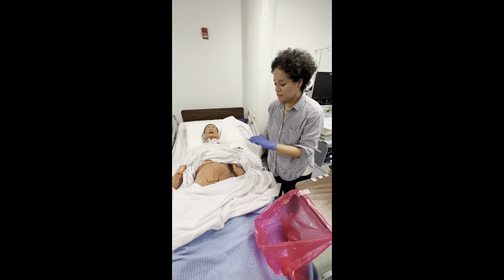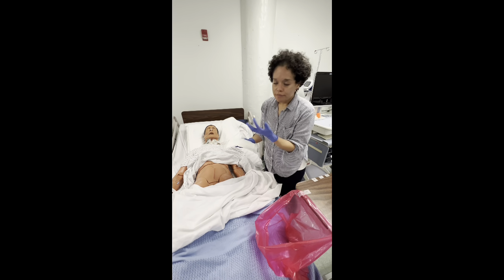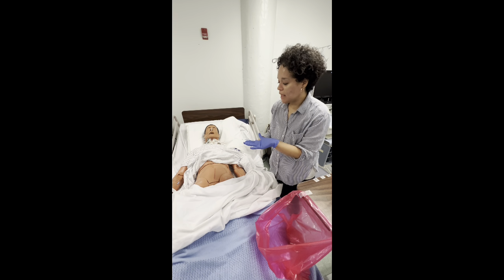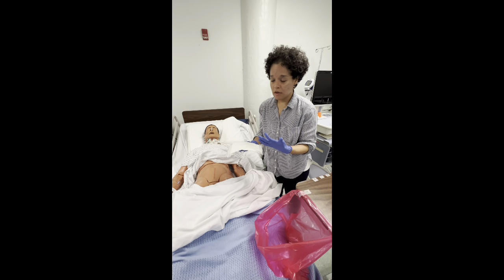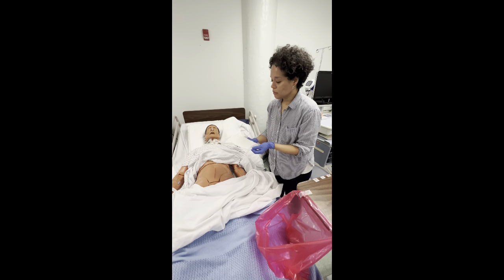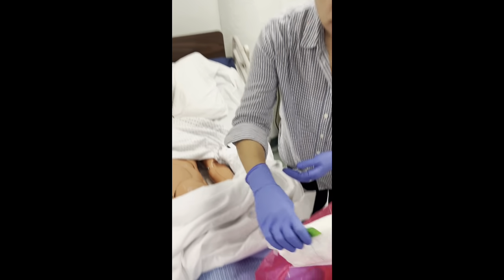And then consistency, you want to see if it looks runny, or if it's slimy, or if there's a lot, and then the amount, and you want to make sure if the pad itself is overly saturated, or it's just very minimal discharge. So make sure you close this, throw this in the trash.